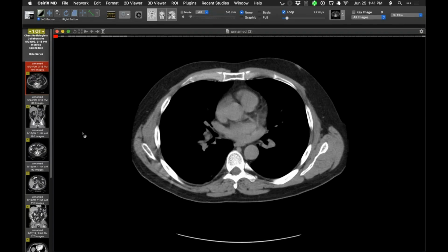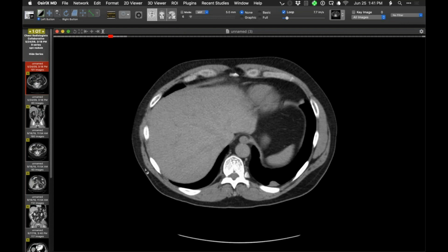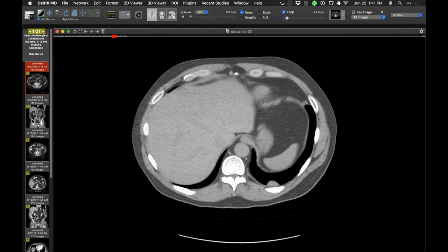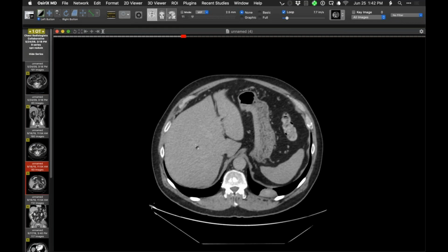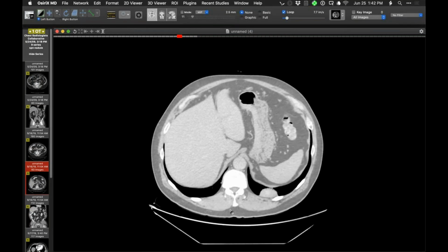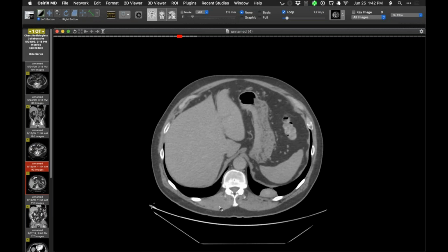Okay, this is an abdominal CT back in 2009. I don't know that this was seen at the time, or perhaps if it was, it wasn't accorded much importance. But just for comparison, this is what the lesion looks like in 2009. So it's got smooth margins. It is clearly a pleural-based lesion, homogeneously attenuating and small. Now let's go forward 10 years, and we'll see, again, this is an abdominal CT, that it is increased in size, but not dramatically so. It still has the same morphology and the same appearance. Perhaps there's a little bit of enhancement within, but otherwise very consistent with a slowly growing tumor, pleural-based.